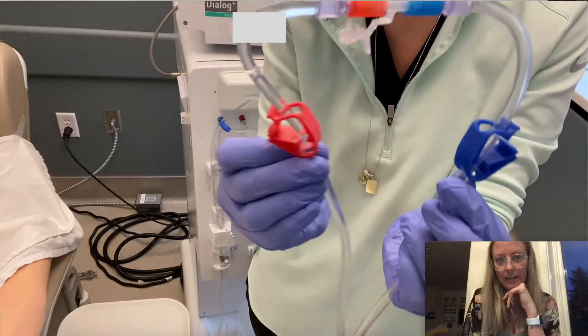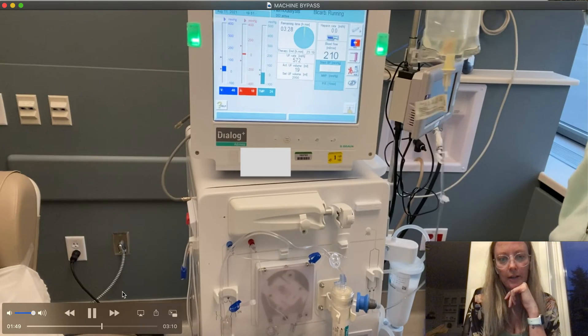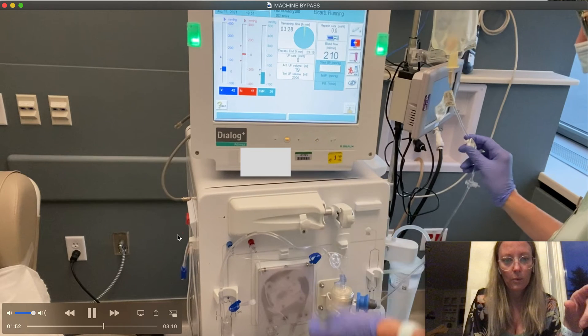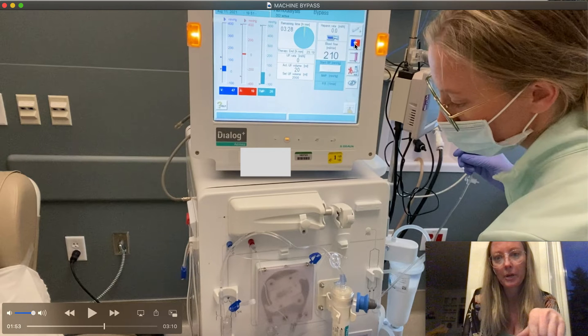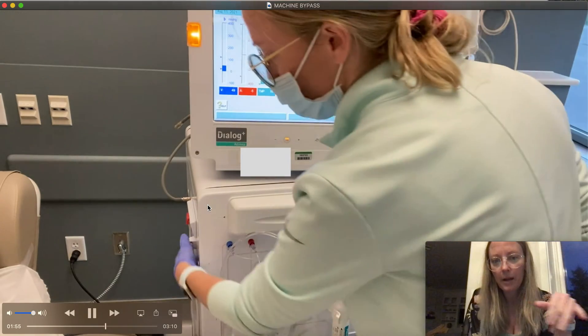I've got it connected, and I want to make sure that all four clamps are unclamped now — one, two, three, four. I have four clamps unclamped. I am going to start the pump and make sure this is in bypass. Looking at the machine — it's not in bypass right now, so I will make sure that goes back into bypass, and then I am going to start the pump.